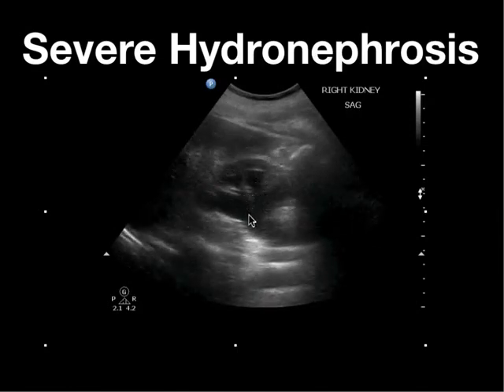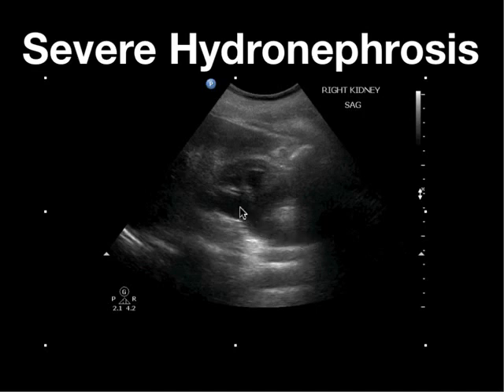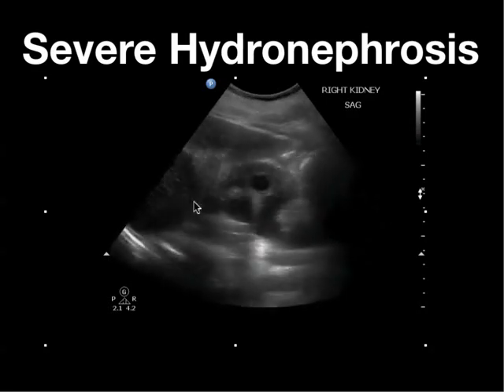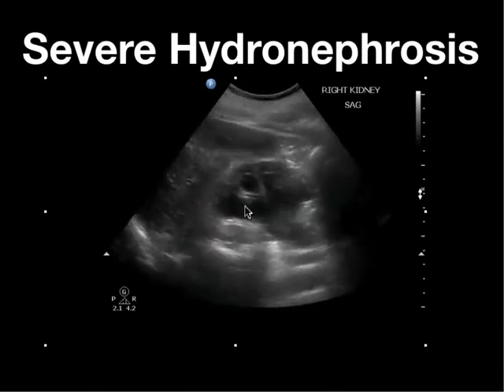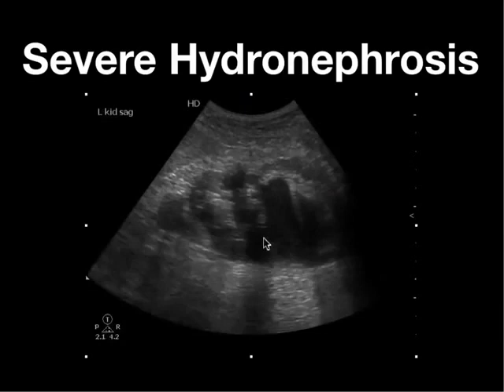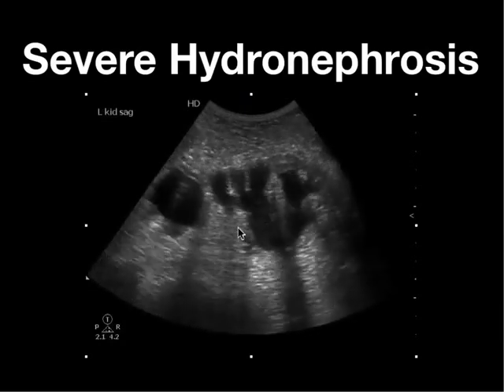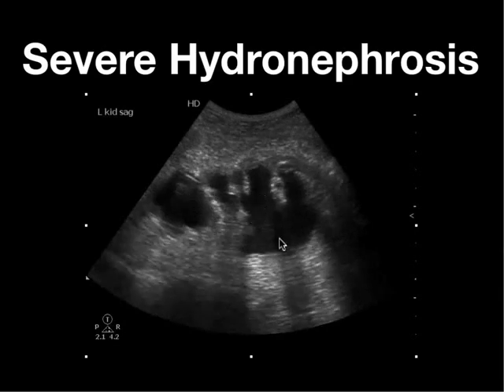Here's a patient with severe hydronephrosis — you can see the minor calyces connecting into the major calyces into the renal pelvis and down into the proximal ureter. These are not cysts because you can see how they all connect — it's a dilated collecting system. Here's another patient with severe hydronephrosis where all these areas connect from the minor into the major calyces into the pelvis.